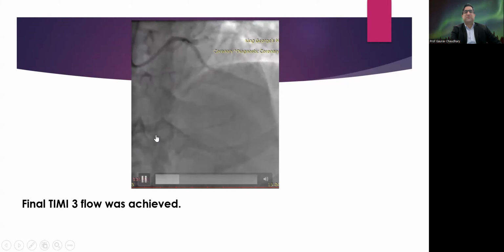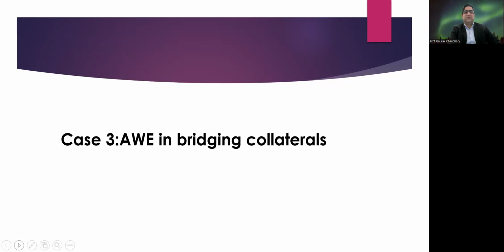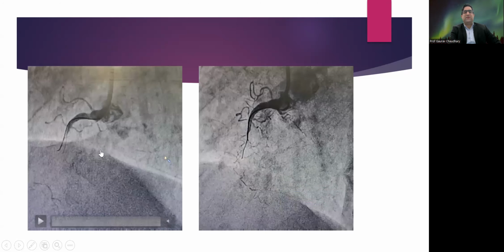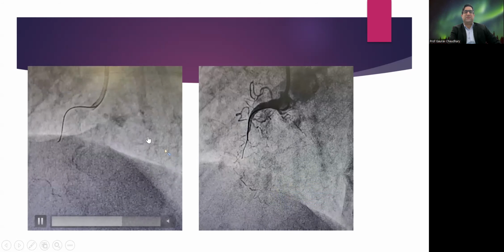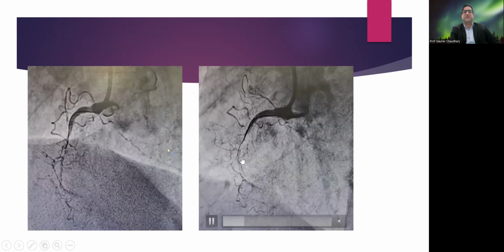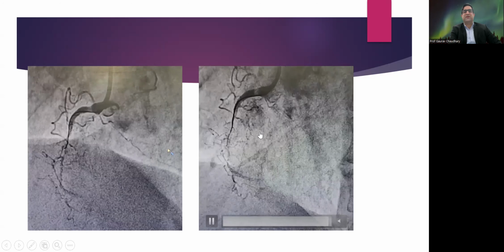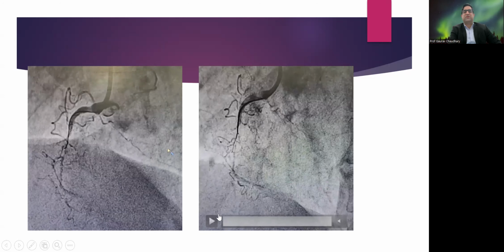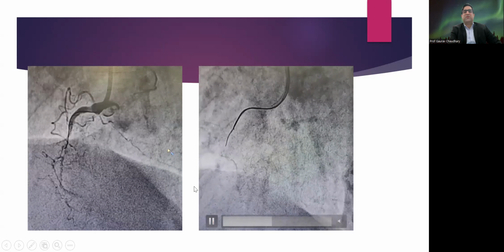So after stenting, this was the end result, and we could see a good TIMI flow was achieved. So many times, what to do if the CTO is having a bridging collateral? So this was the CTO of RCA, and again as a part of the strategy of a sliding technique, we took a Fielder XTR wire. But this XTR, despite having a tip load of 0.6 and this tapering, could not go into the true lumen, and probably it is going into some small bridging collateral.